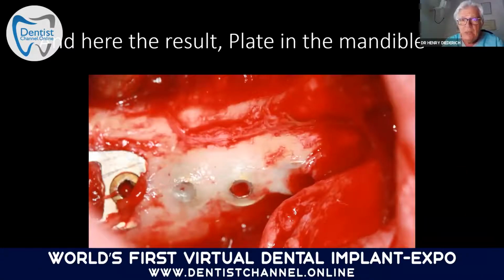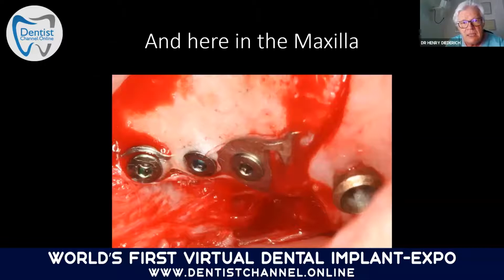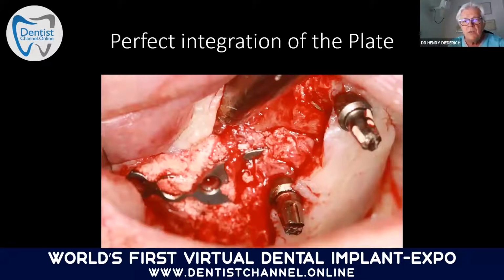So here, we are not speaking about a subperiosteal implant. No, we have a plate which integrates in the bone. Look here, this peak, or here also in the maxilla, the bone is growing over the plate. And here also, another time, a perfect integration of this plate. And we are doing this by minimal invasive procedure because we rest on the bone.